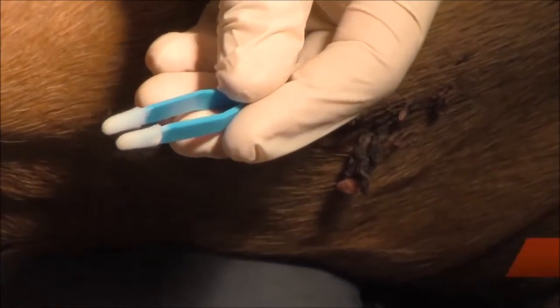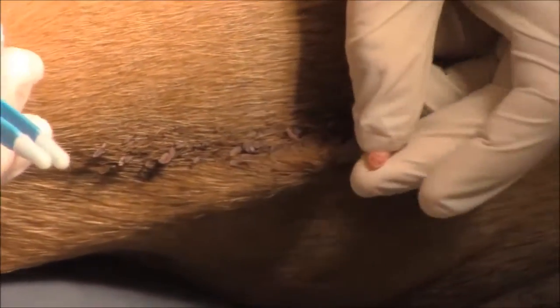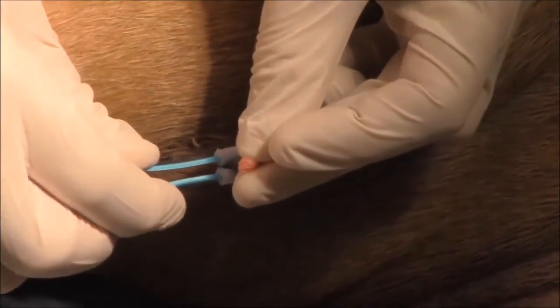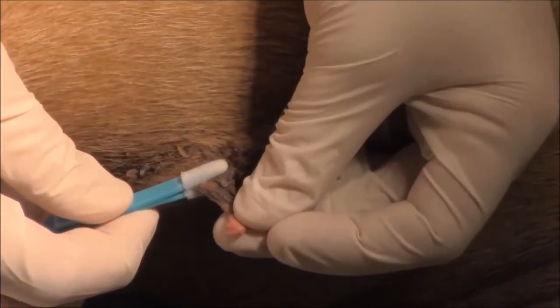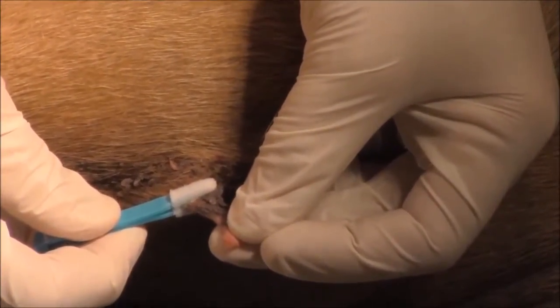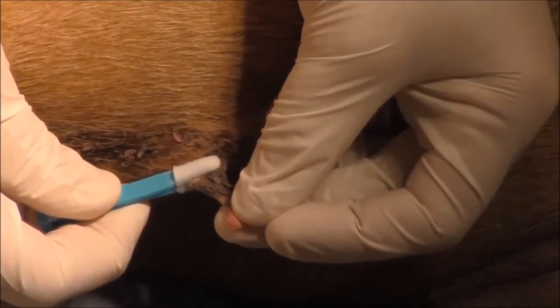We're going to let it sit for about 15 seconds, then I'm going to pick the skin tag up and press this on the skin tag. We're going to hold it — press and hold. Right there. You can see Angus is not even moving.